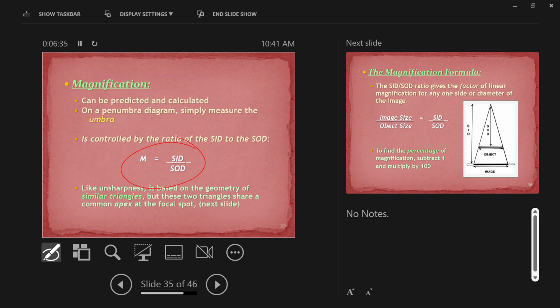We don't get scared of things like that because we've got phones and calculators. Times 1.04. That hand is now going to be 7.9 centimeters on the radiograph. How much bigger did that hand, or the metacarpal of the hand, get? It got 0.3 centimeters bigger. 4% bigger, 0.3 centimeters bigger. That's what it came out to.